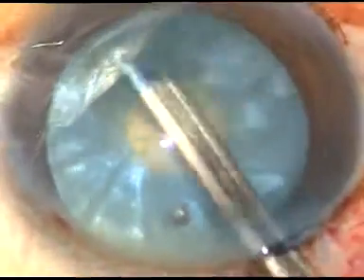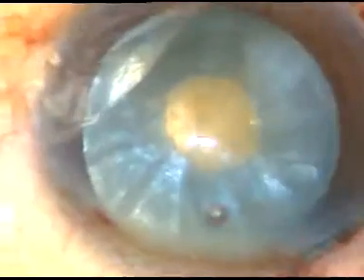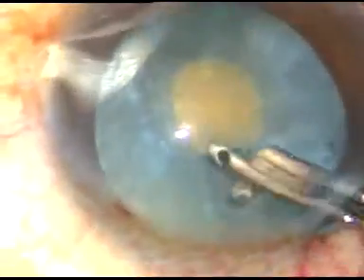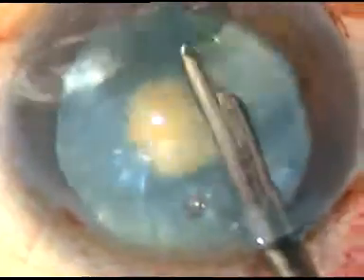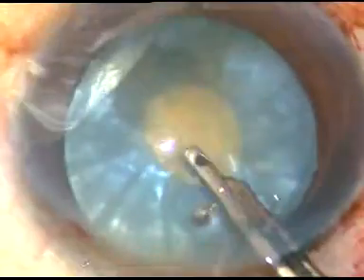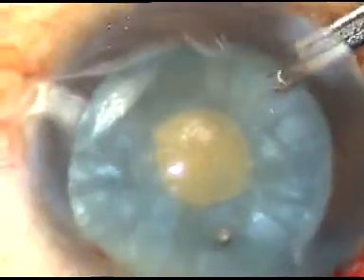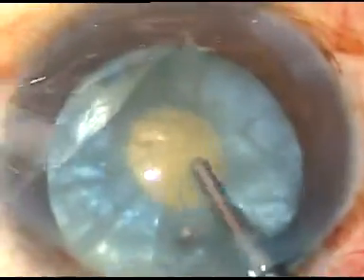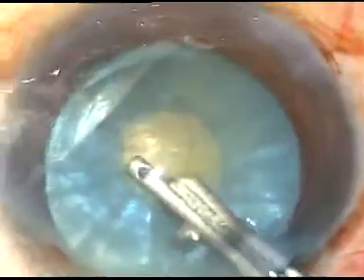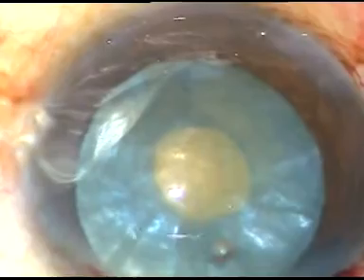Some cortical lens matter is being aspirated through this small opening. And as soon as some lens matter is aspirated, the intra-lenticular pressure drops drastically. And this small rhexis can be easily enlarged into an optimum-sized rhexis. At that time, there will be no tendency of the capsule to run out.